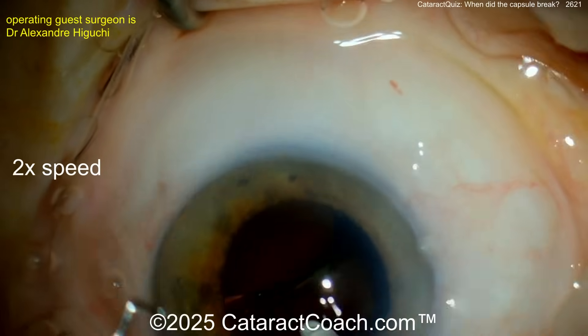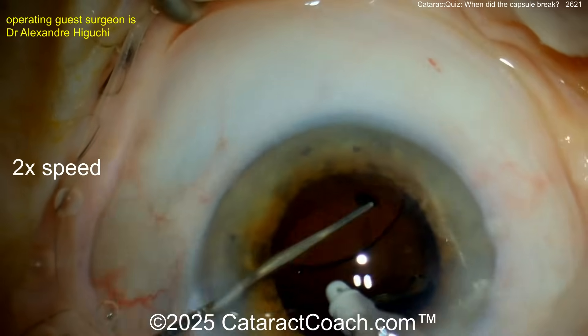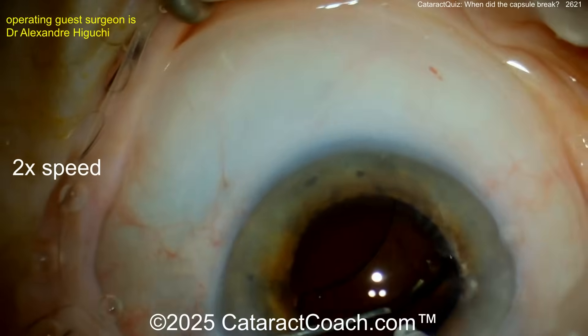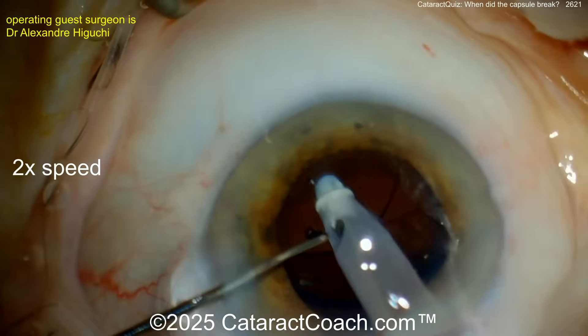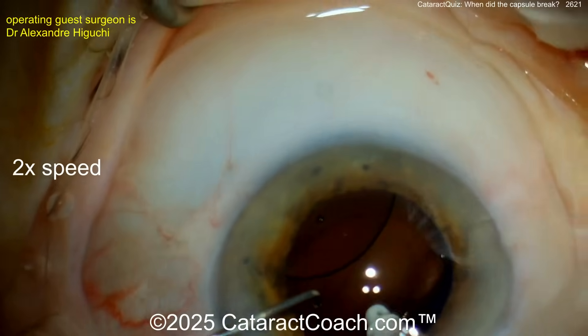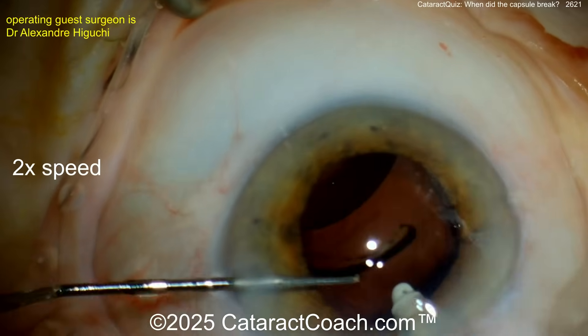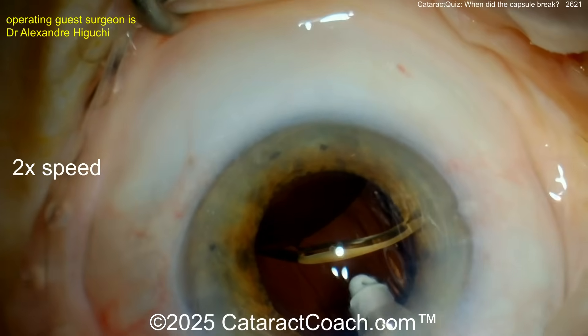No, no, no — you need to get this lens out. Don't try to push it into position. Get it out before the whole thing falls into the vitreous cavity. You can try to center it, but at this point it's entangled in vitreous. I would just get that last haptic and pull it out of the incision — do not let it fall back.